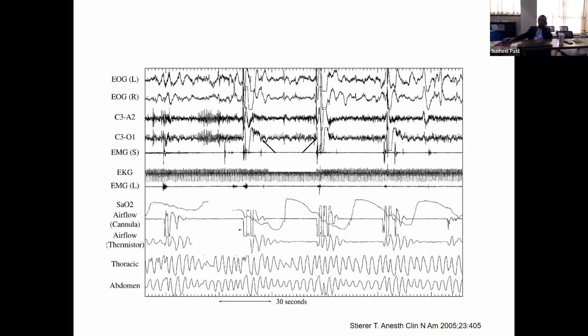Yeah, exactly. And I think one of the things you can see here, I don't have the arrows, but there is paradoxing that's occurring towards the end of this. They're not in sync, they're actually countering each other. So that gives you increased confidence that this is obstruction that's occurring as well.